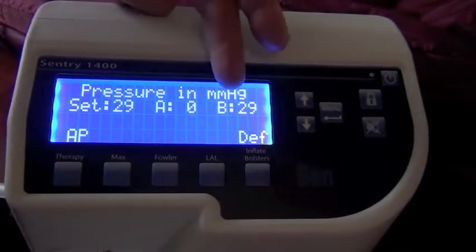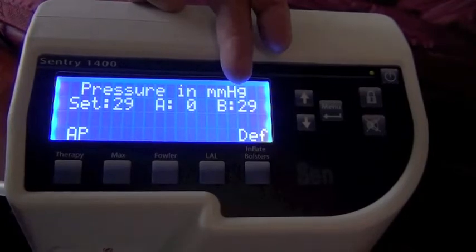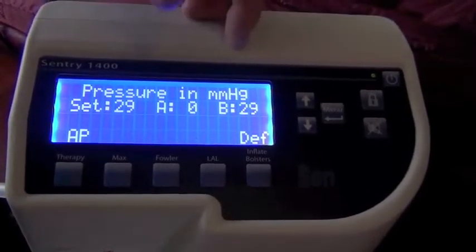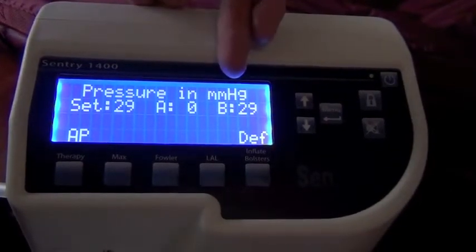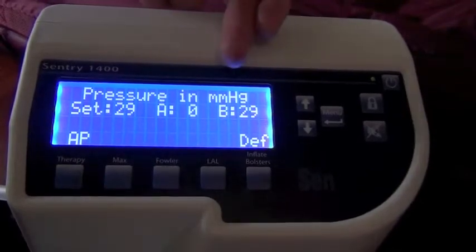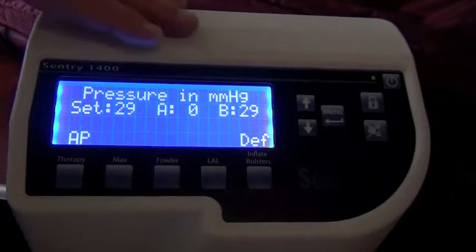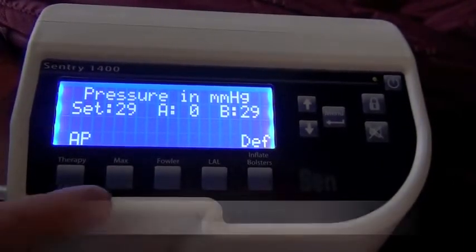We're switching from cells that are inflated to cells that are suddenly deflated. And the deflation process probably takes less than a minute to transition from one to the other. Again, subjecting tissue to pressure for 5 minutes and then offloading that tissue for 5 minutes. And we're doing that continuously around the clock. So it's a very aggressive, very effective pressure management tool.